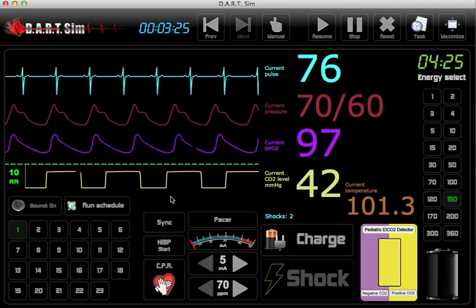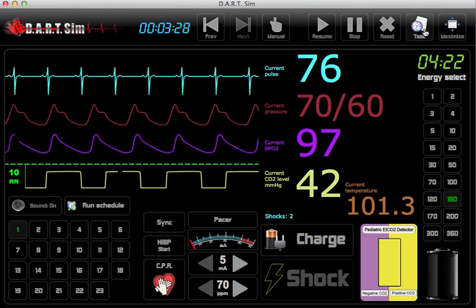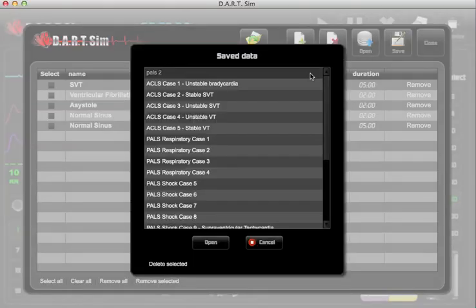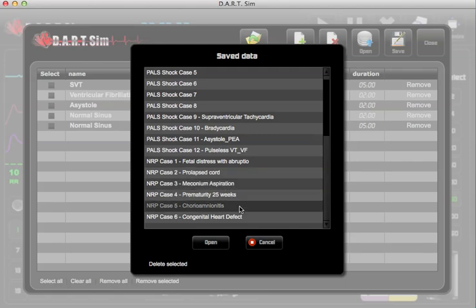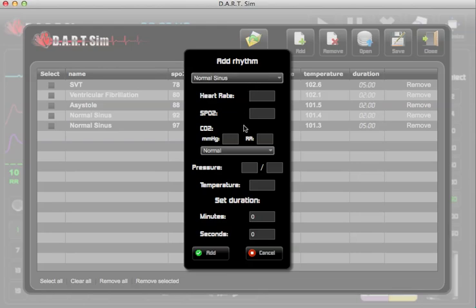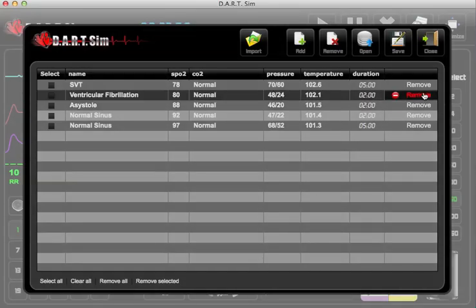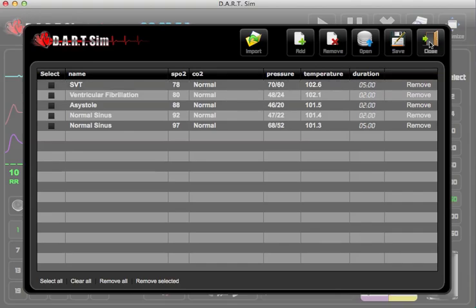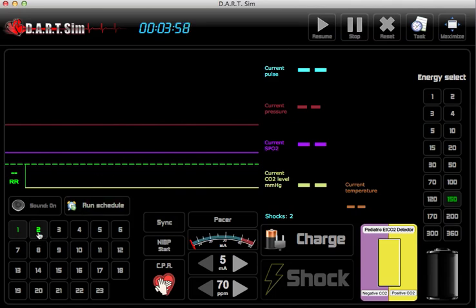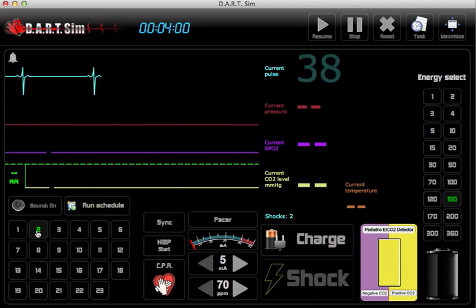And that was one of our scenarios that we have preloaded. If you want to check out more scenarios, go to our task, open, and you can see we have all of our ACLS, PALS, core cases, as well as NRP scenarios loaded for you. You can also create your own custom scenario as you wish. You can also reset and go into manual mode and use it strictly as a rhythm simulator only.